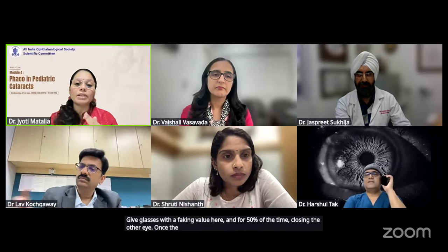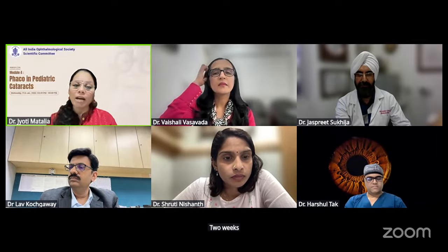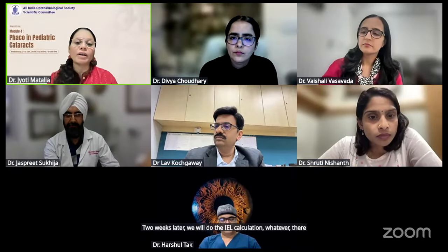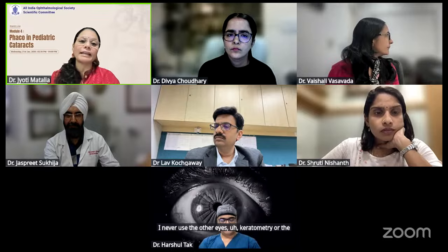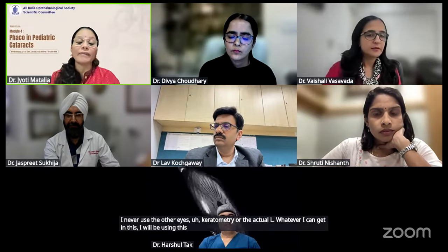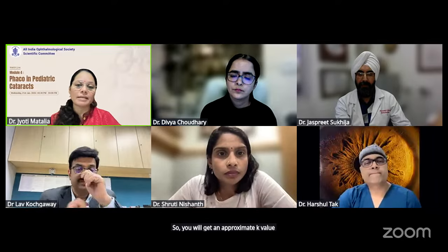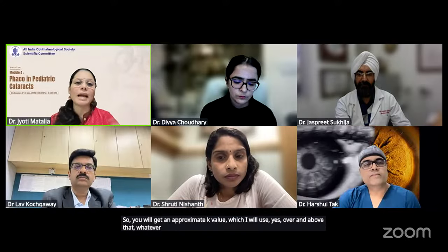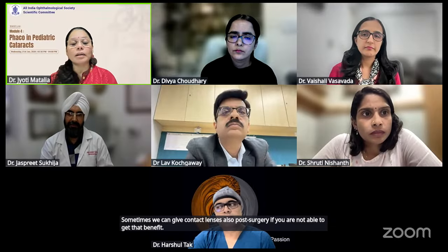Once the corneal sutures are healed, I would be removing the corneal sutures. Two weeks later, we will do the IOL calculation. There will be a huge range, but whatever mean K we get will be used. I never use the other eye's keratometry or the axial length. Whatever I can get in this eye, I will be using. Until now, I have never had an issue where I could not get it. So you will get an approximate K value, which I will use. Over and above that, whatever residual comes in as a refractive glass power will be given thereafter. Sometimes we can give contact lenses also post-surgery if you are not able to get that benefit of refractive correction.